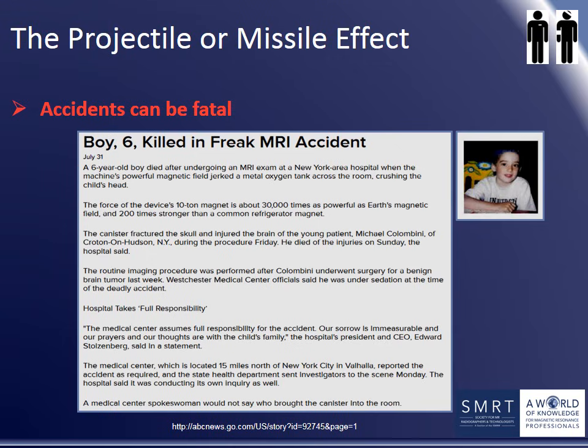The anesthesiologist turned to approach the boy with the oxygen tank when the magnetic attractive force pulled the oxygen tank from the doctor's grasp. The tank was drawn with great force to the center of the scanner where it struck Michael in the head, causing fatal injuries.